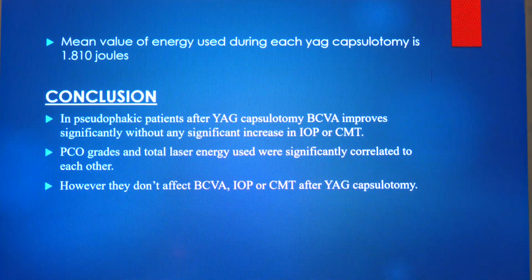Conclusion: in pseudophakic patients after YAG capsulotomy, BCVA improves significantly without any significant increase in IOP or CMT. PCO grades and total laser energy used were significantly correlated to each other. However, they don't affect BCVA, IOP or CMT after YAG capsulotomy. Thank you.